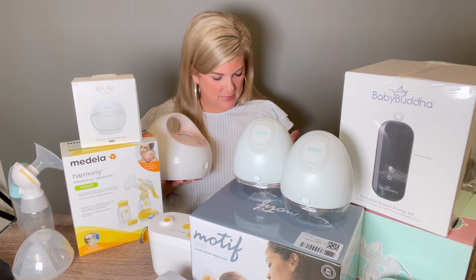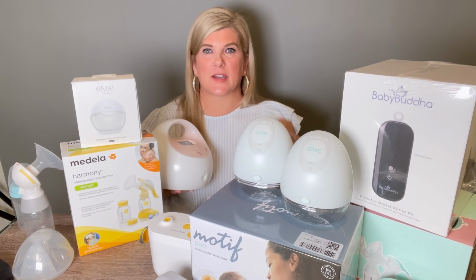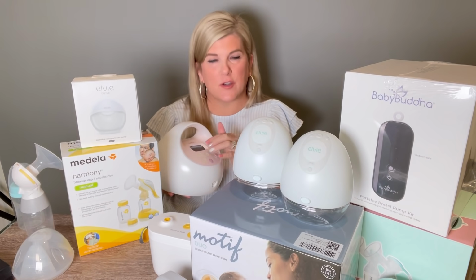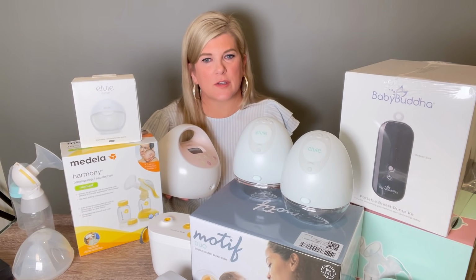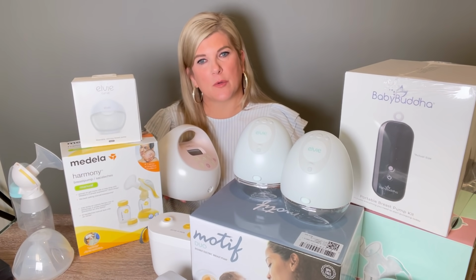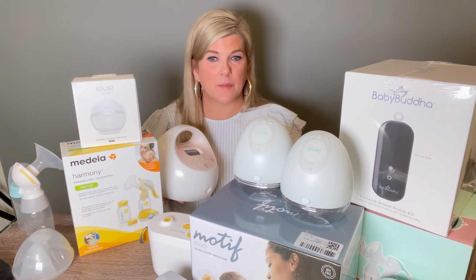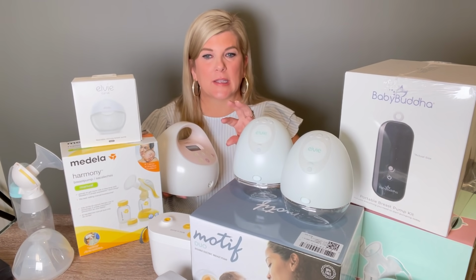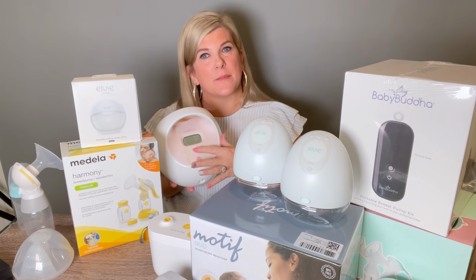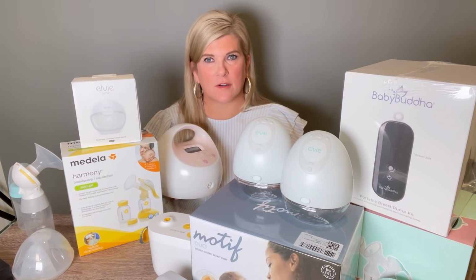But letdown is the first stage of your breastfeeding experience. And they all work in different combinations, right? So if you get like the Amida, they have your vacuum strength and your cycle speed, and you adjust those according to what a typical letdown mode would be. So what does letdown mode mean? It means that it's the first stage and your breast milk is going to start to come in. And the baby mimics that by doing a light, fast suckling motion. And that's what your letdown mode does on your pumps, a light, fast suckling motion. And that's how a baby says, hey mom, your milk needs to come in.